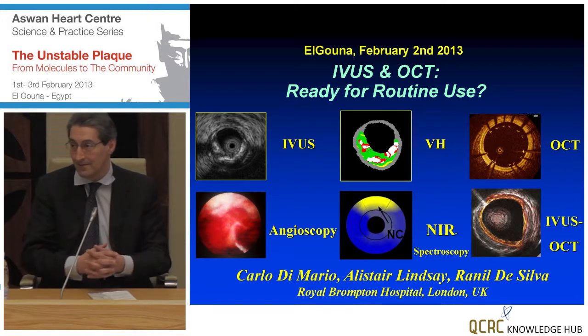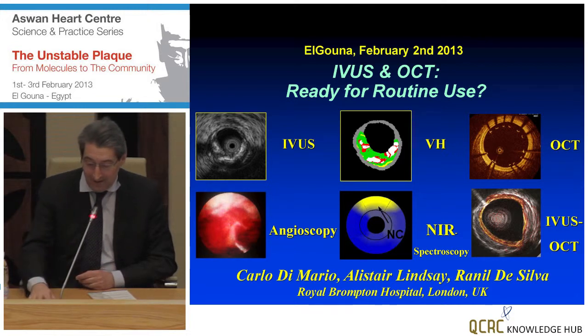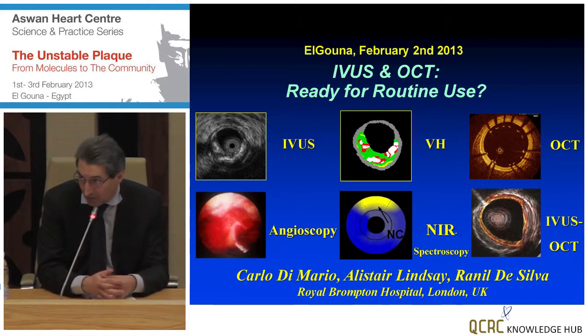Last question: to what limit is OCT preferable over IVUS in patients with renal impairment? And is there any particular creatinine clearance at which using OCT is totally safe? Well, obviously intravascular ultrasound has an edge when you have renal impairment, because you don't have to inject contrast to obtain intravascular ultrasound images. I've done some procedures myself almost completely without angiography, purely repeating assessments and passages with intravascular ultrasound. With OCT, definitely you have to pay attention to the amount of contrast you inject.